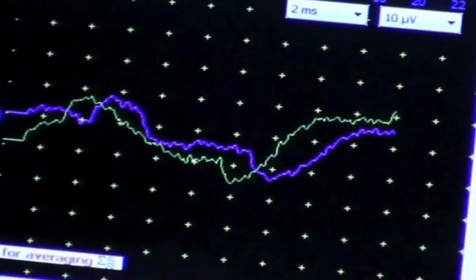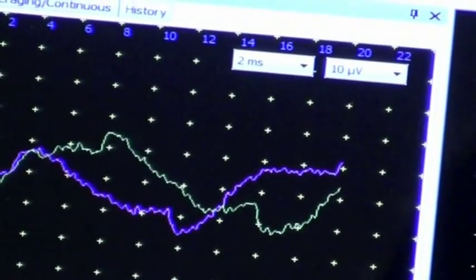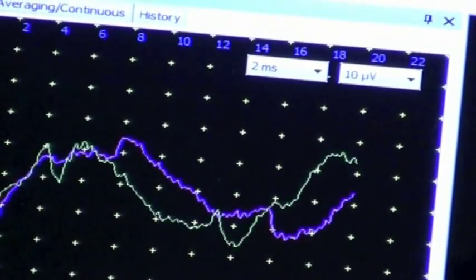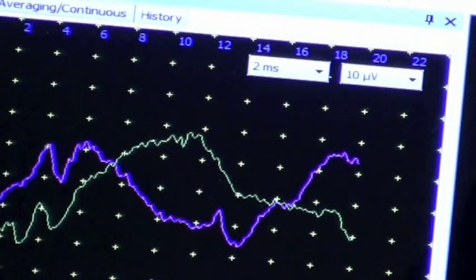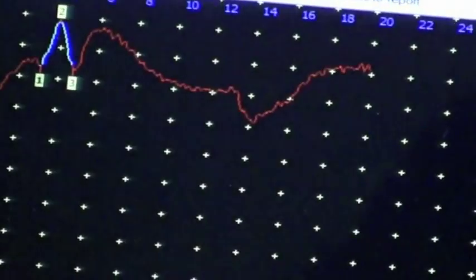Again, are you feeling this going down your foot? A little bit. Okay, so let's do here. How about now? Yep. You feeling it more? Okay. Here we go. You're going to begin to see a response here. That's the green one. Yeah, actually here, this way. And here is a very nice response, and I accept that.